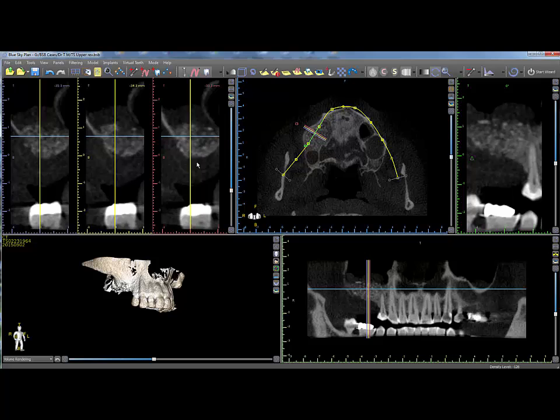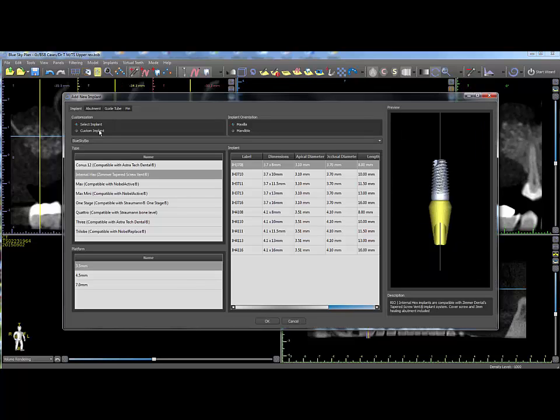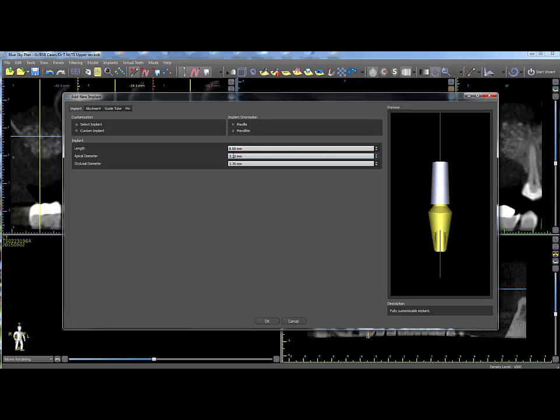Additional functionality is available in Blue Sky Plan that will greatly facilitate treatment planning. Customized implants can be created by clicking on the Add New Implant icon, then clicking on Custom Implant and entering values for length, apical diameter, and occlusal diameter, then click OK to place the implant.